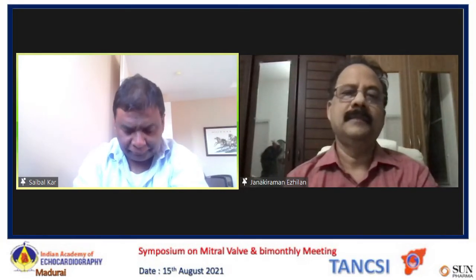They made a cutoff of ERO of 0.2 as severe MR. And since this is an echo meeting, you know, Dr. Amuthan, that whether you have functional MR or degenerative MR, ERO of 0.2 is not severe. The new criteria is ERO of 0.4 is severe for all categories.